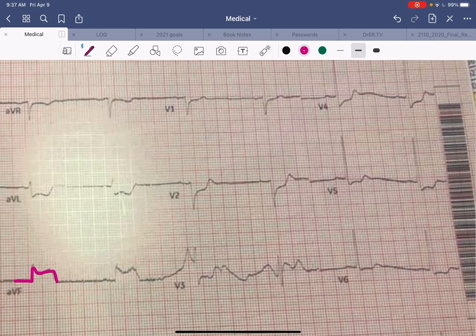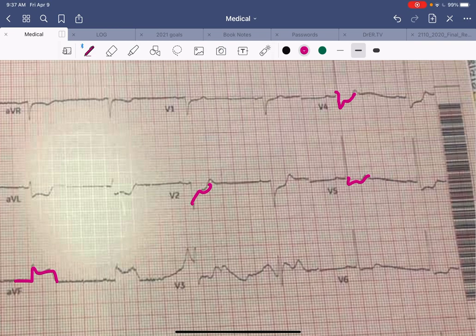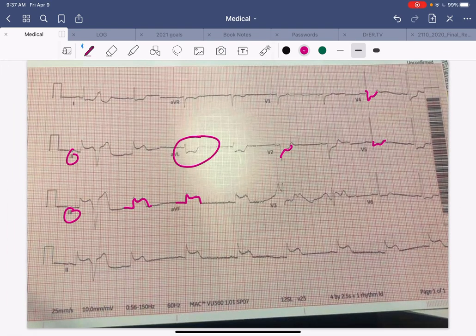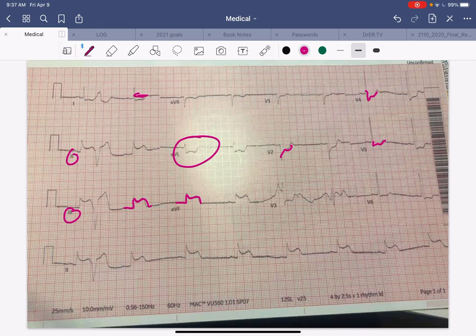You can also see what are called reciprocal changes — ST depressions on the lateral leads, here and here, on AVL, and even a little depression over here. So this is a very large inferior ST segment elevation MI with reciprocal changes in lead one, AVL, and the lateral leads V2 through V5. This patient has a STEMI — ST segment elevation MI.